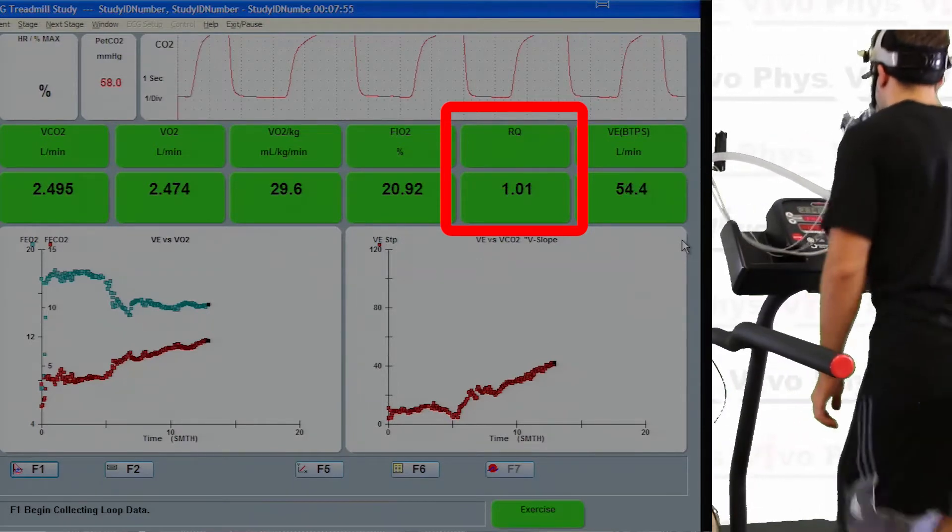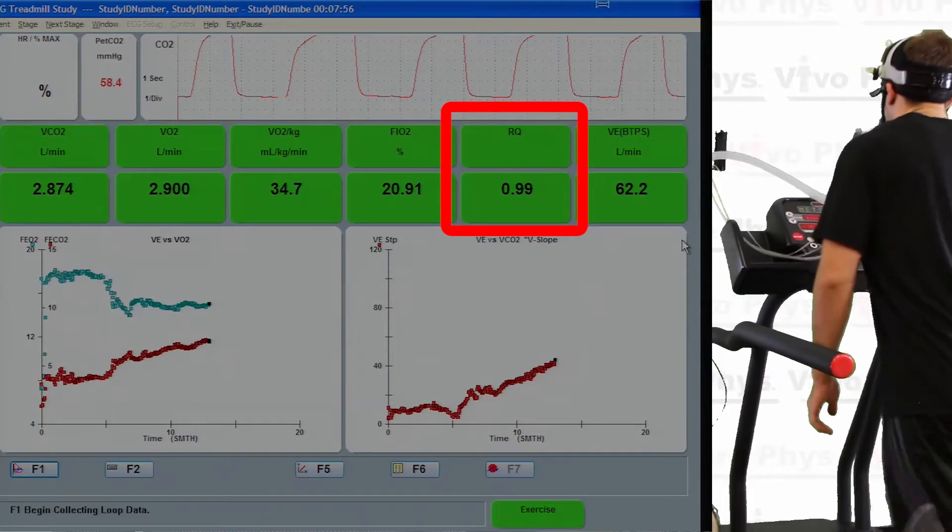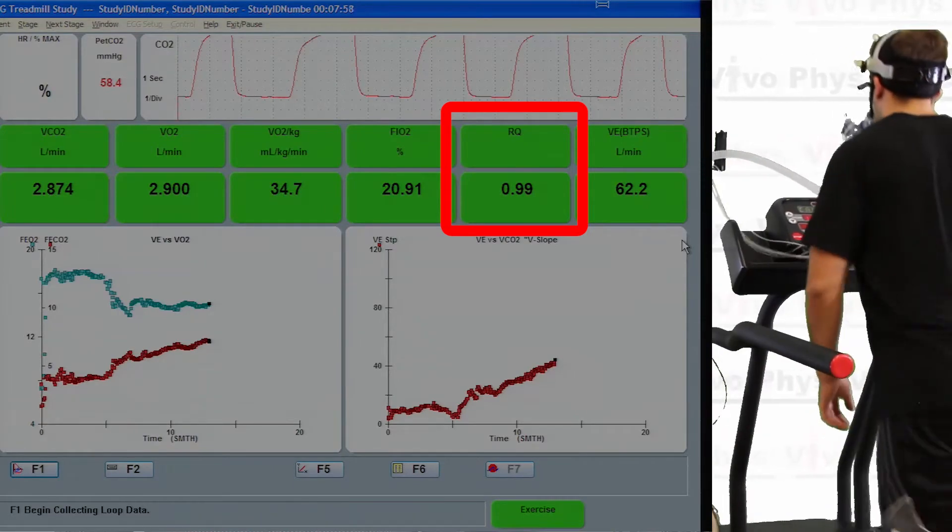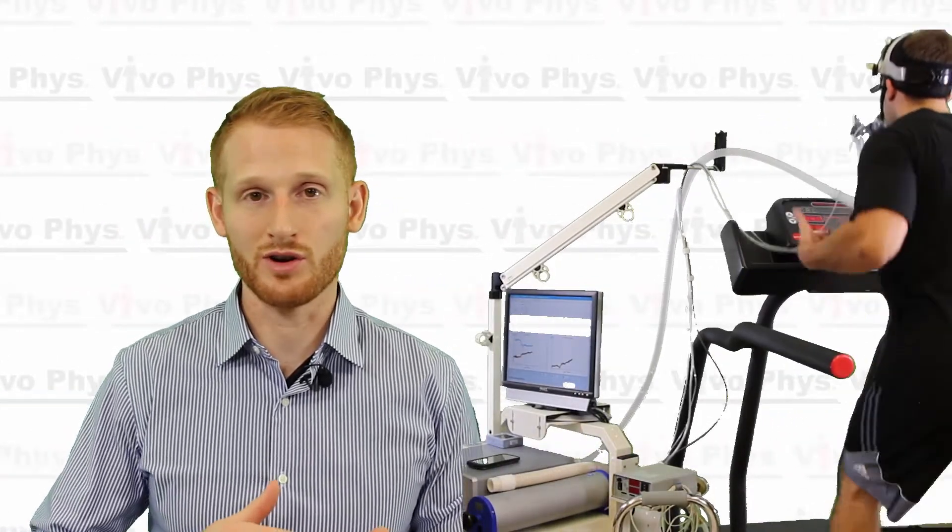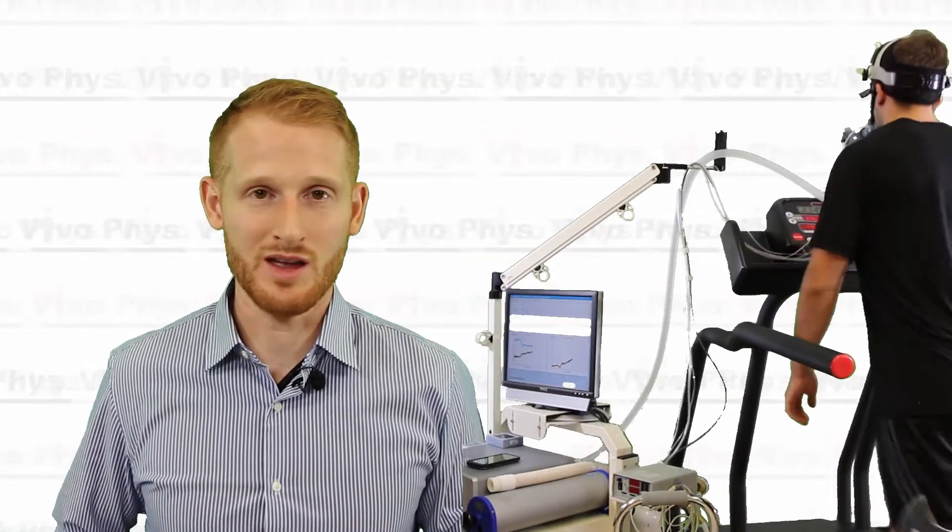Once it gets over one or near one, that's usually when the person starts feeling that they're getting very fatigued and it's a pretty strenuous exercise bout. That's what I usually look for while doing one of these tests. I look for that RQ or RER to get around one, and that's when I really start to encourage them and make sure I'm watching them closely.